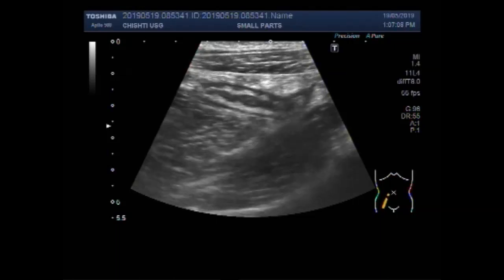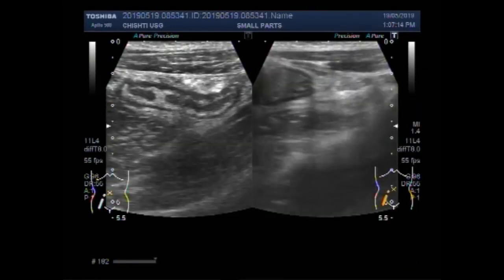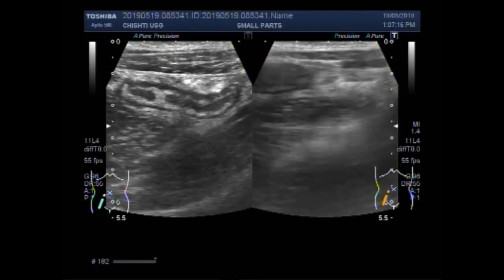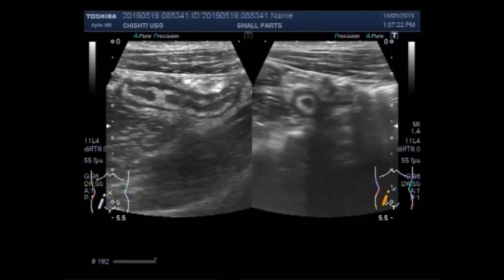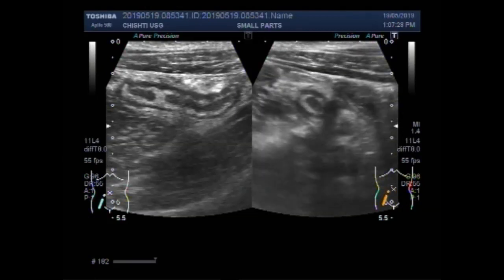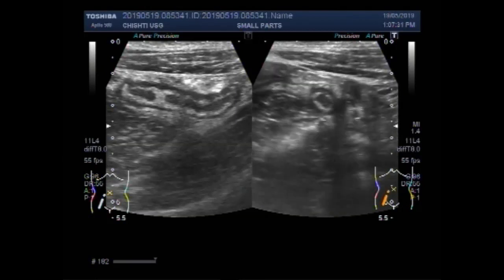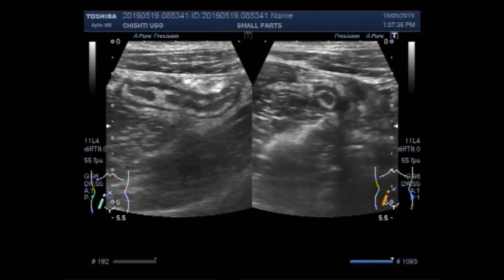This seems to be very simple but it requires a bit of practice. Again you can see the probe lying transversely. This is the acute appendicitis.